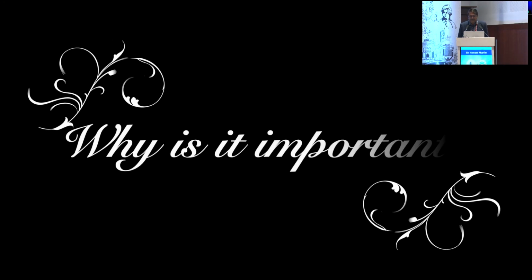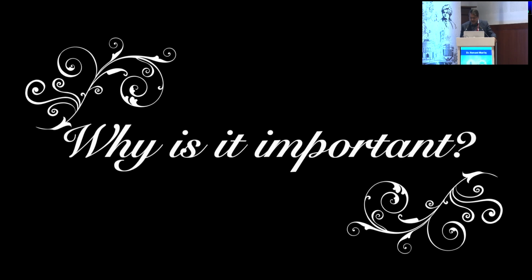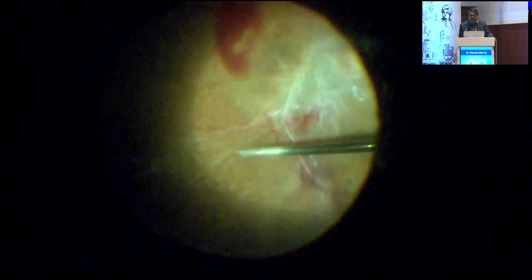Actually, I'm just using a spatula in this to help you understand this cleavage plane, which extends beyond what is clinically apparent. And once you do this, this membrane starts coming out very easily. So whenever you have a situation wherein further surgery is not possible, you know that there is a secondary membrane. It's important because the entire surgery becomes a lot easier.